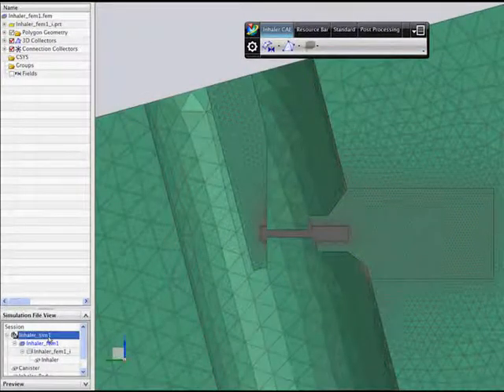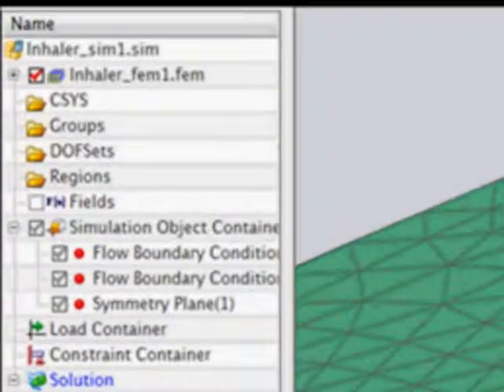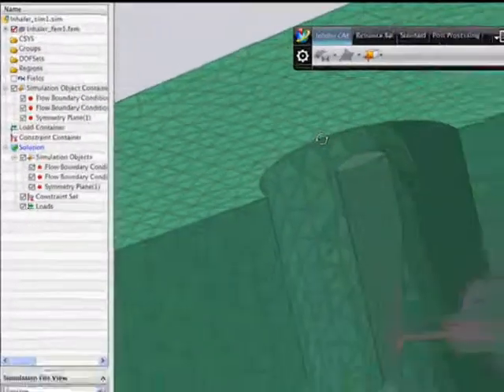Now that the mesh and fluid properties are defined, you can apply boundary conditions. Here, boundary conditions have already been applied at the injector inlet to represent the pressure release through the valve when the patient presses down on the pressurized canister. A second boundary condition represents ambient air conditions at the inhaler exit.